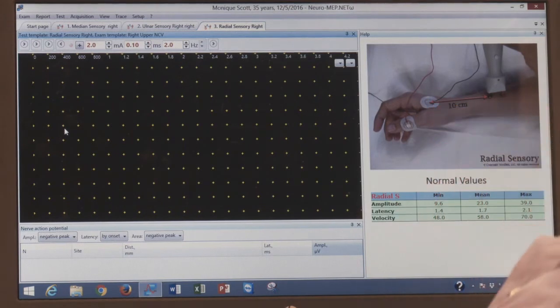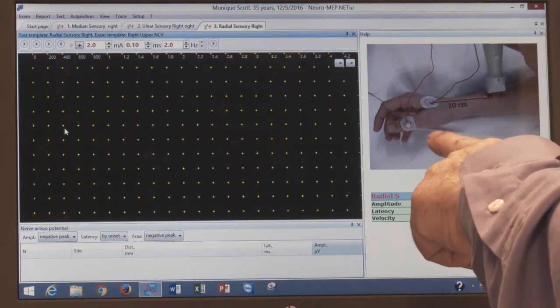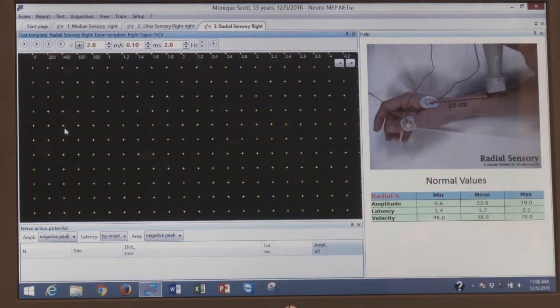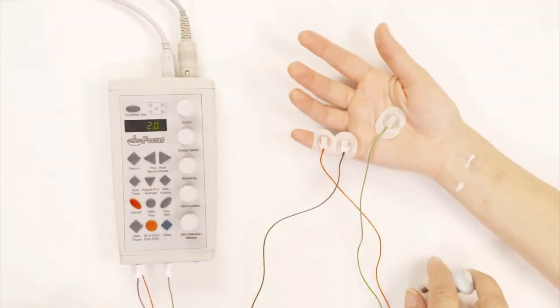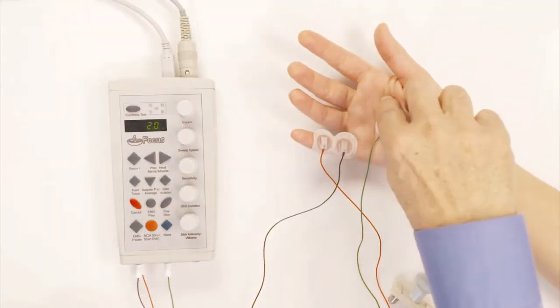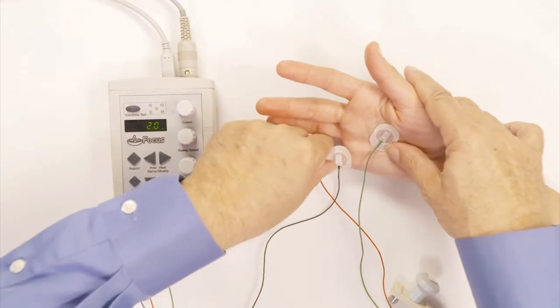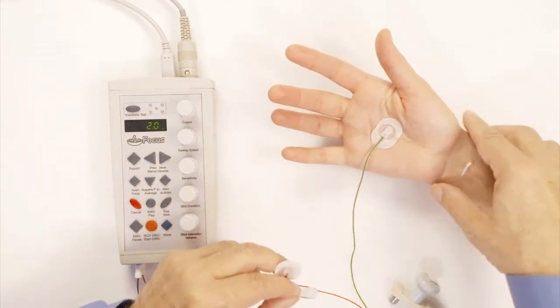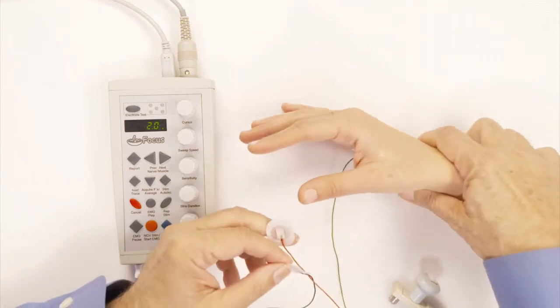I will put the black electrode right between the index finger and the thumb, with the reference electrode, the red one, on the thumb. I'm going to take these electrodes off and ask her to turn her hand like this so that I can put these electrodes on.